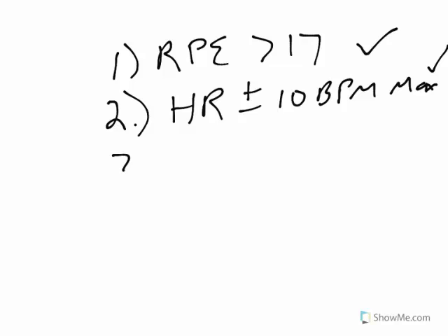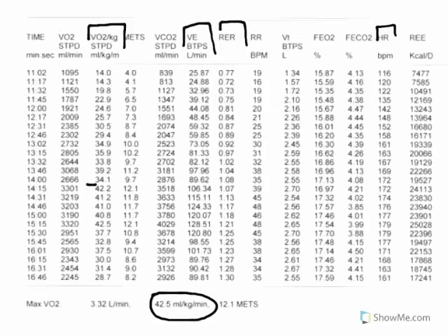The third thing that we look at is the respiratory exchange ratio. This is signifying what Curtis is burning for energy. At rest, you burn pretty much mostly fats. At peak exercise, you're burning almost 100% carbohydrate. That's what this column signifies.